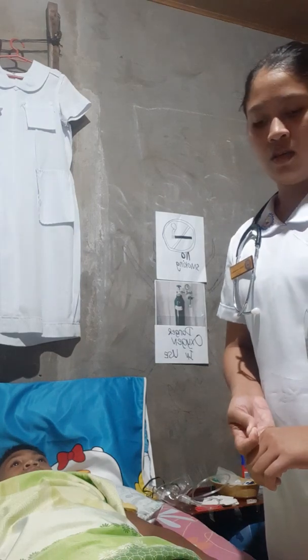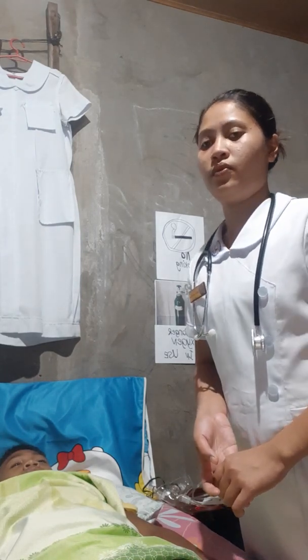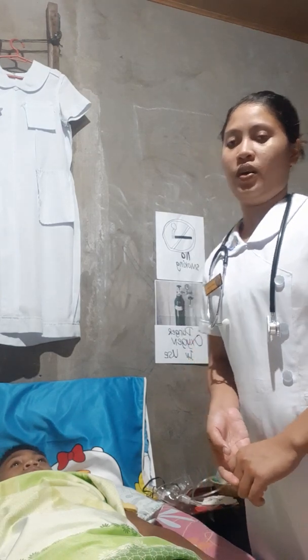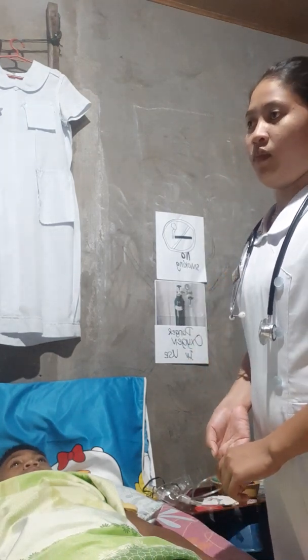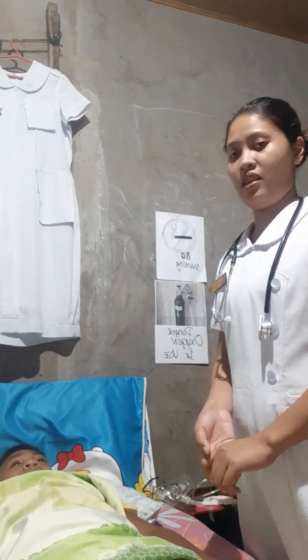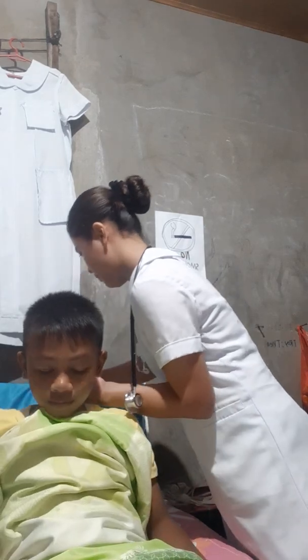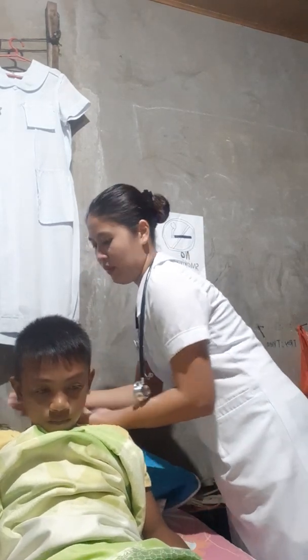Next, for the planning, assist the client in the semi-Fowler's position because this position permits the client's chest expansion and hence easier breathing. So, excuse me, sir, can you help yourself up? Please lay down. Thank you.